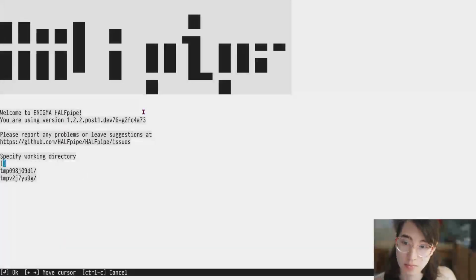Maybe there will be a new release by the time you are watching this video, but in general, usually the latest version is a good choice because it will have all the newest bug fixes. But once you're committing to a project, it's often good to use the current release and to make sure that it works. And that you can just say, yeah, we used this version of HALFpipe, and then everybody knows which version you used.